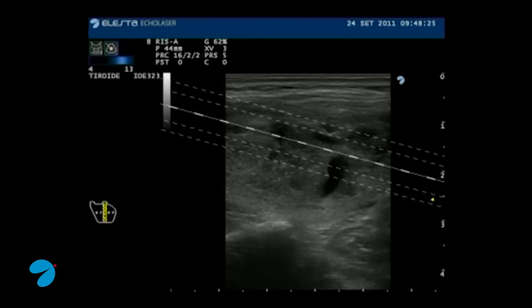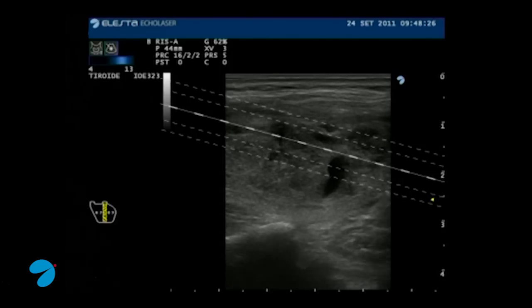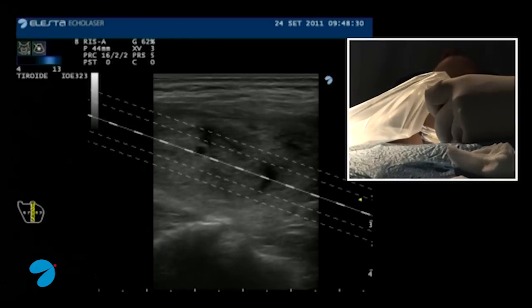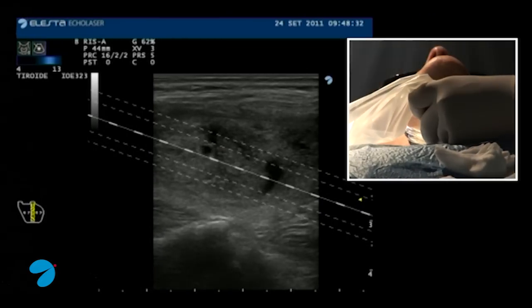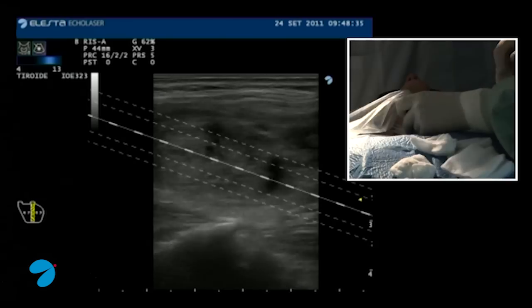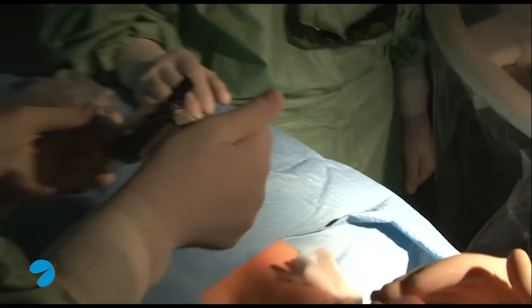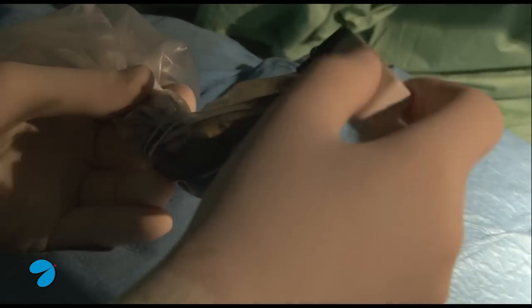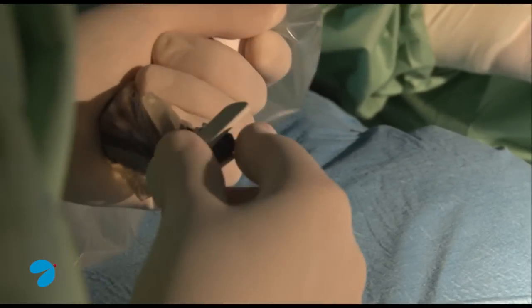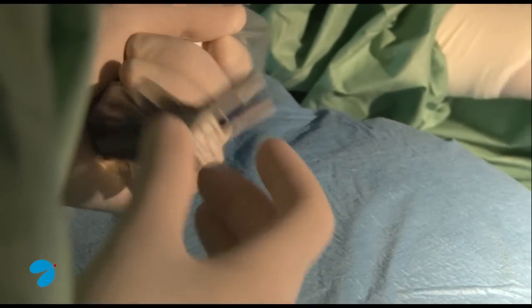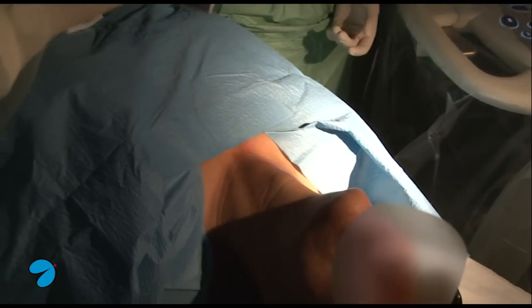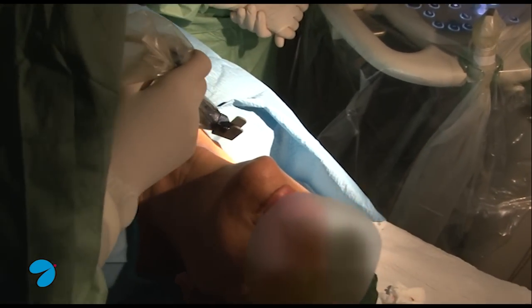This is the active phase of the procedure. We proceed to select the correct guide system in relation with nodule dimension, position and neck morphology. We choose the most appropriate needle guide system that we mount on the probe. We place the probe with the guide system on the patient's neck.